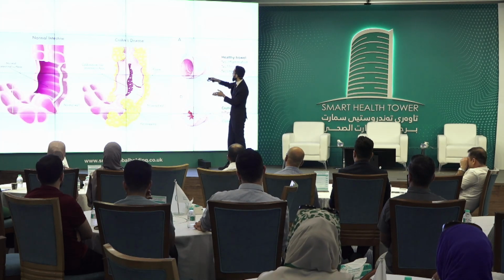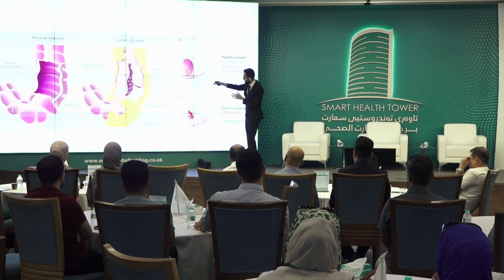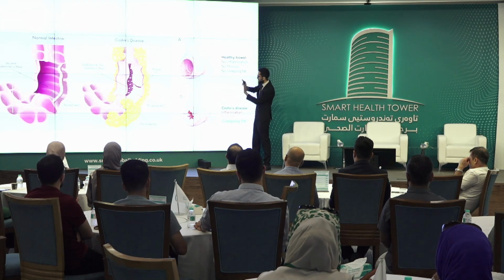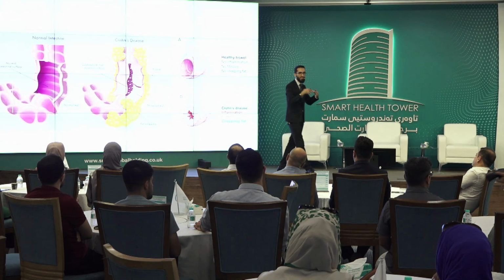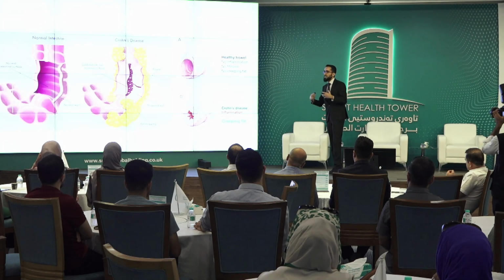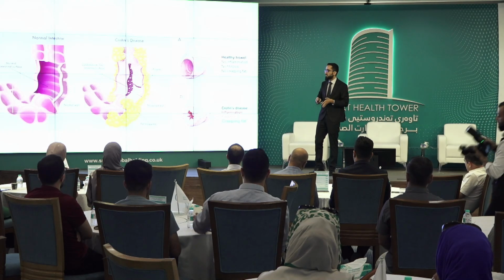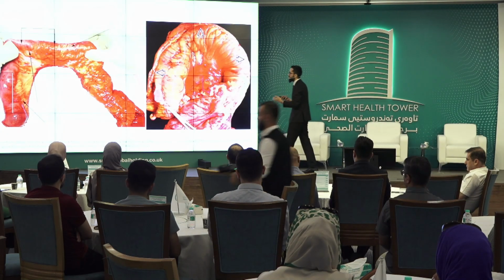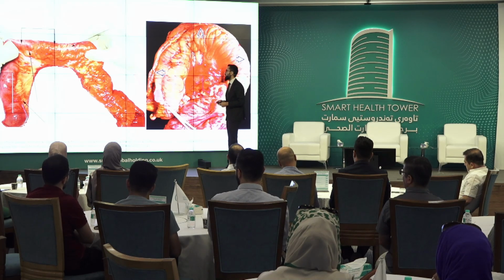The second finding is that the mesentery normally connects to one point or one pole of the bowel wall. Within Crohn's disease, this mesenteric fat will start to creep along the length of the adjacent bowel wall, and this is because of inflammatory cytokines that are released within the bowel wall. Now, it's important to know that the fat is now believed to be not just a passive bystander, but also contributing to the disease inflammation itself, as adipocytes can secrete cytokines that will further the inflammation in the bowel wall.